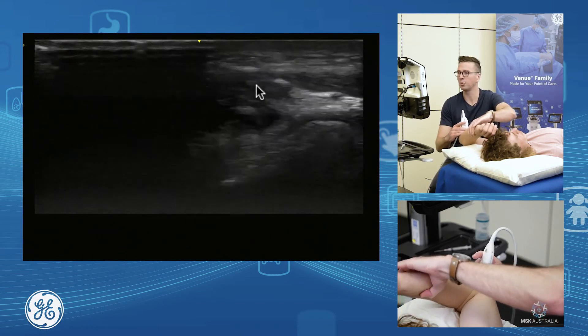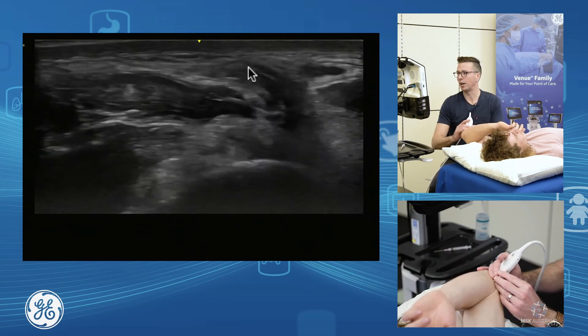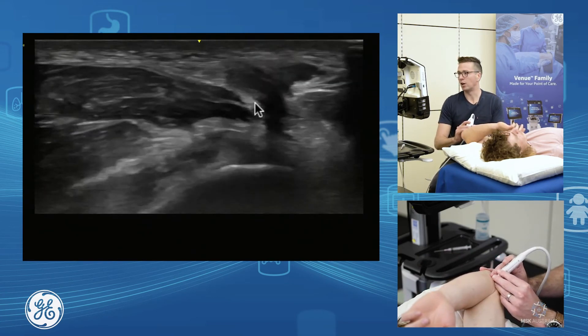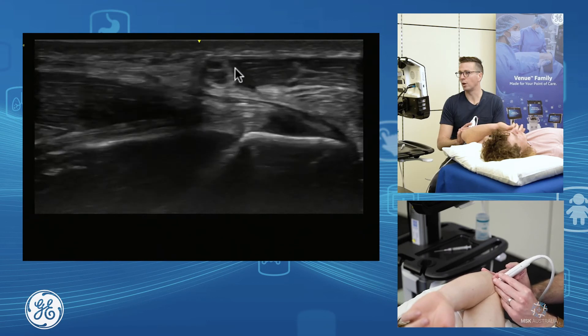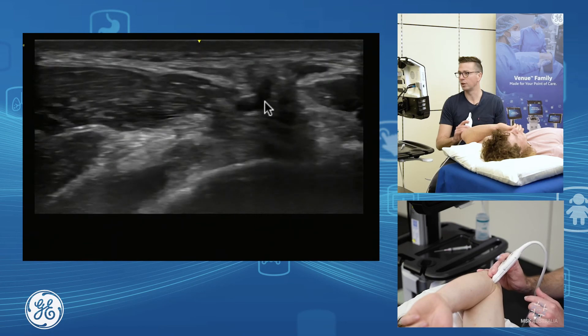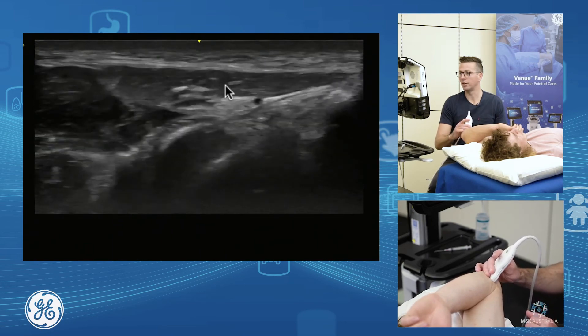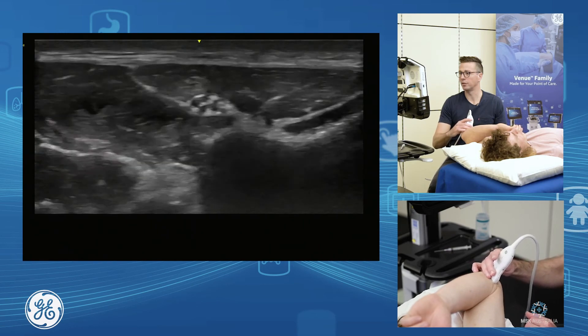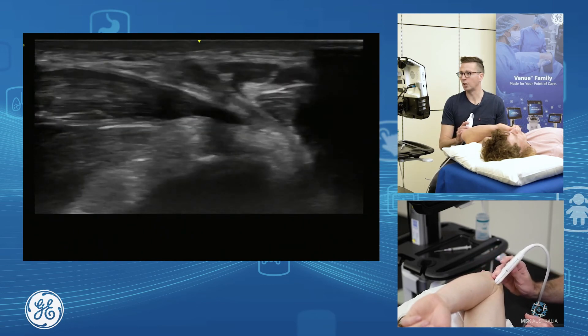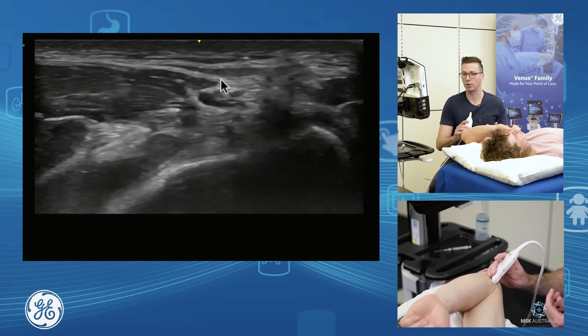Let's put in a bit more flexion. As we add a bit more flexion, we can see the ulnar nerve goes from sitting on top of the common flexor — quite a long way on top — to wrap around the FCU aponeurosis, out through here, to go down into the forearm. So this is our common point of FCU entrapment: between the two heads of flexor carpi ulnaris.